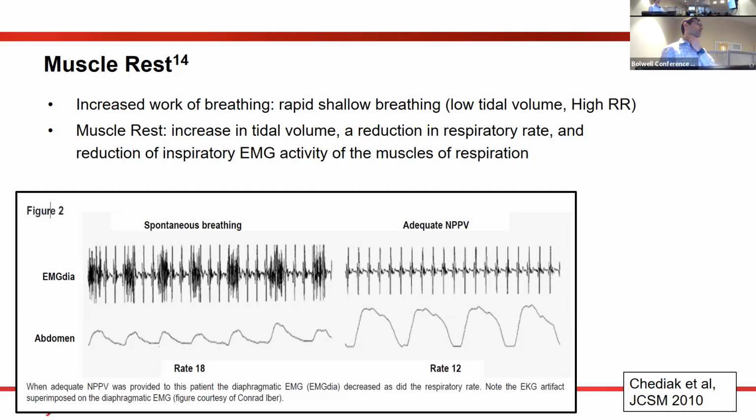There's the iron lung. It's for negative pressure. It's inspiration. It pulls things in, and then expiration is passive. There used to be a thing like a shell, an abdominal cuirass, that would put negative pressure.